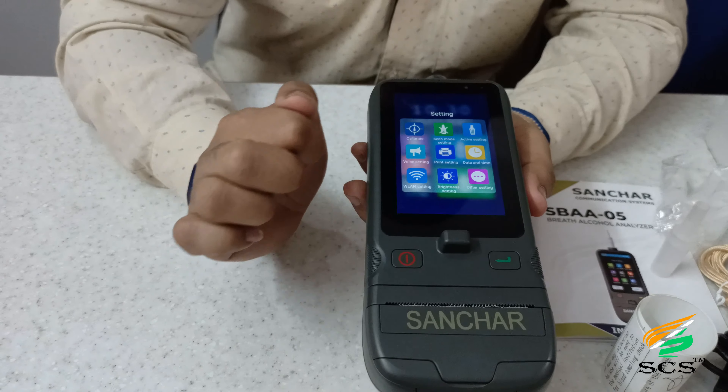Print settings: if you want to enable sign printing, use this option. Image enable: if you want records without a picture, disable this option; otherwise keep it enabled. Input print signature: the user can fix their name so they will not need to write it again each time. Date and time option: the user can set date and time manually. WLAN setting: by this the user can easily connect the device to any Wi-Fi network. Brightness setting: the user can easily control the screen brightness.